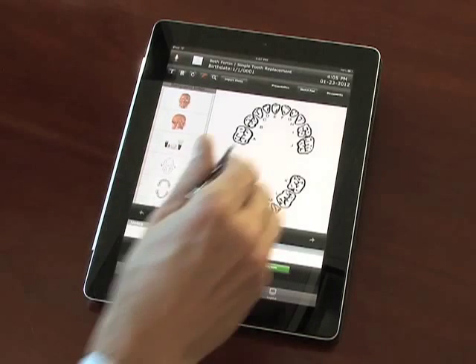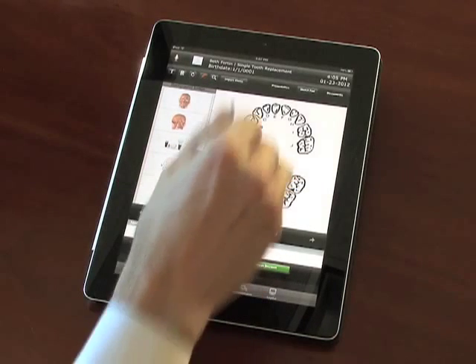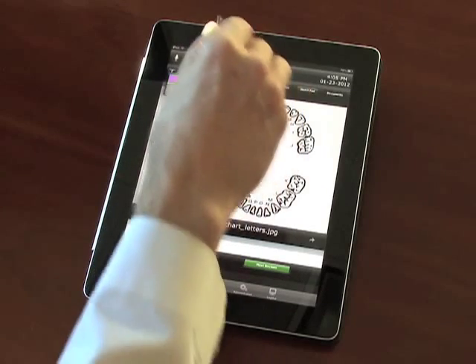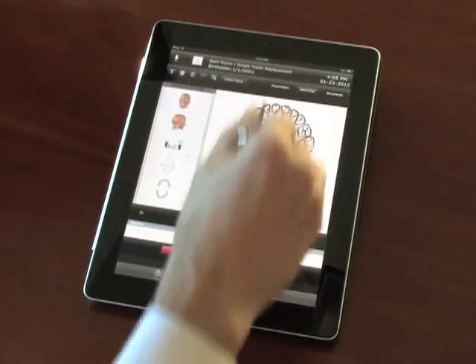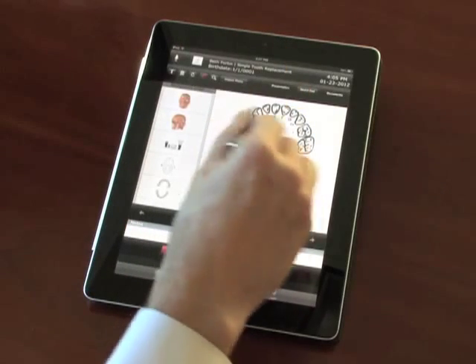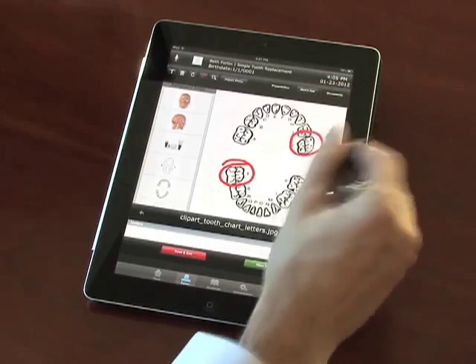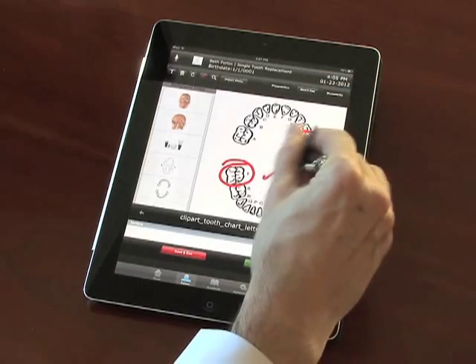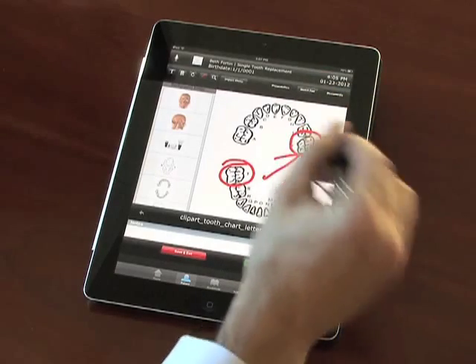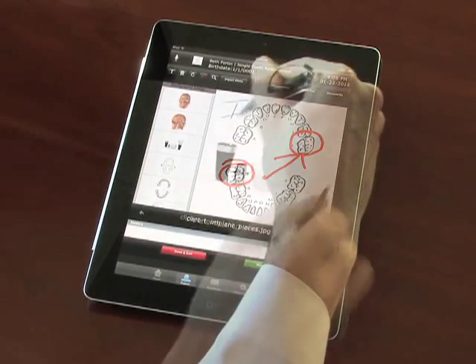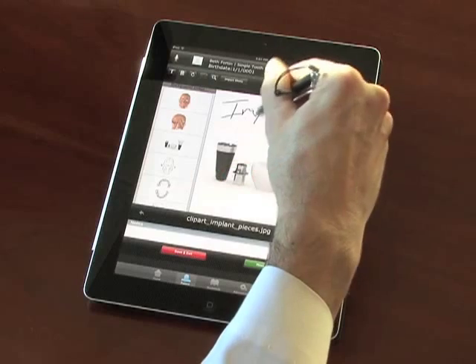In the Sketchpad, you can pull up template images or draw on a blank screen to illustrate concepts of the procedure. The Sketchpad will also allow you to add your own images, such as X-rays, to draw on.